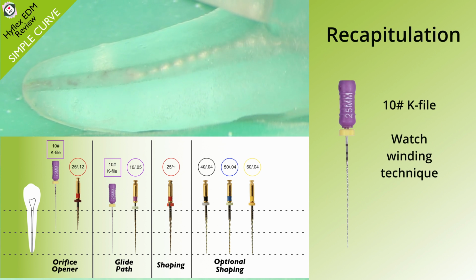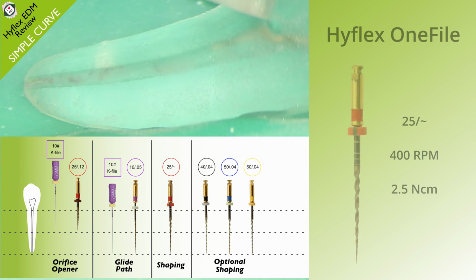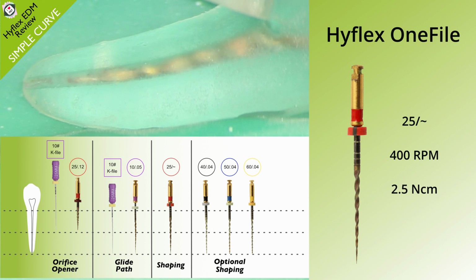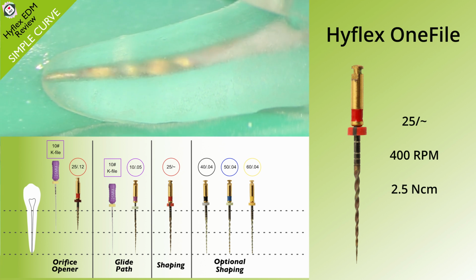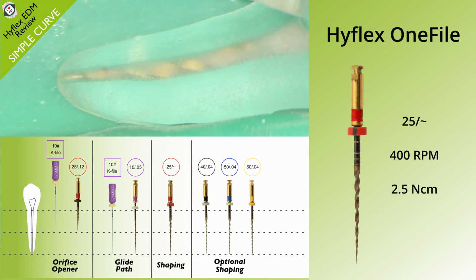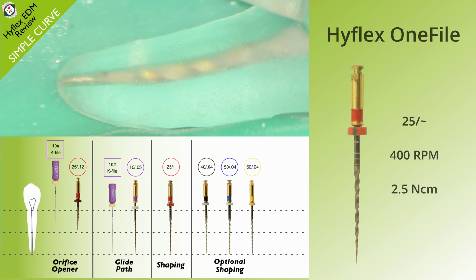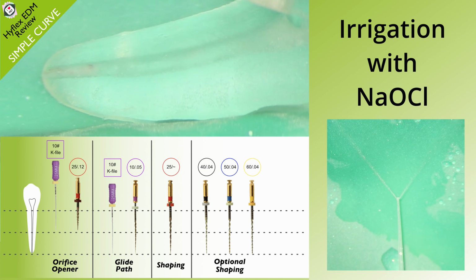We're going to then recapitulate with a size 10 file, make sure we get out all the debris so it doesn't block the canal. And then we're going to use the size 25 preparation file. This is the Hyflex 1 file, and as you can see, this goes really easy to length. And lots of irrigation.